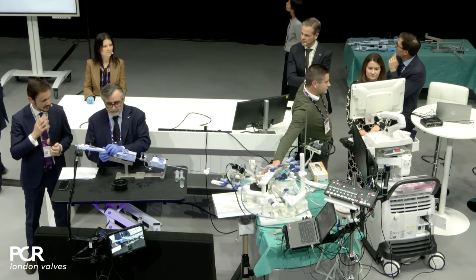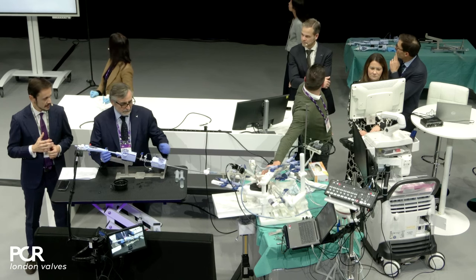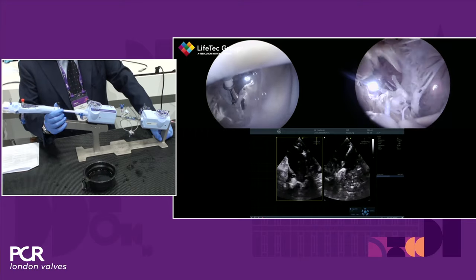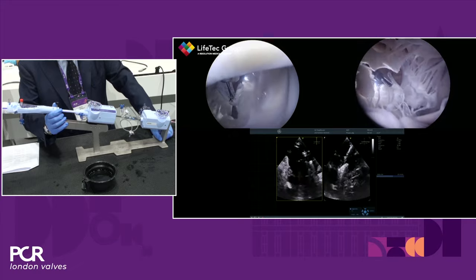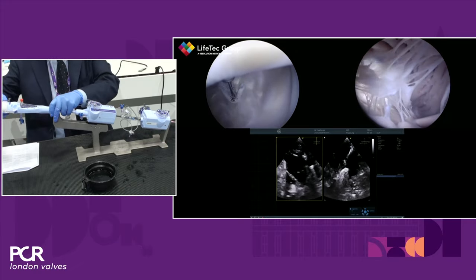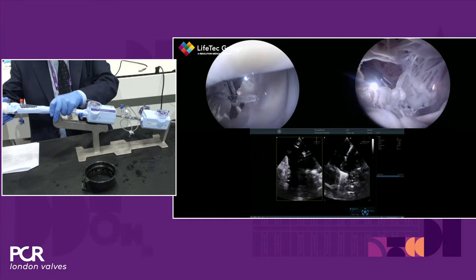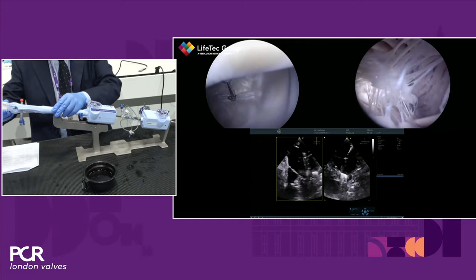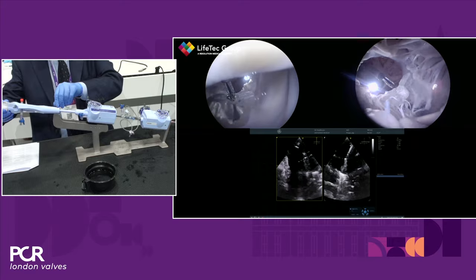Once you are above our target, guided by echo, we check that our trajectory is coaxial and we are ready. Paolo is now checking the trajectory. We open the clip and we position ourselves perpendicular to the line of coaptation, in this case the anteroseptal line of coaptation. As Francesco said before, the key for success in edge-to-edge repair is to respect the symmetry of the valve, which is the key difficulty we face in real life.